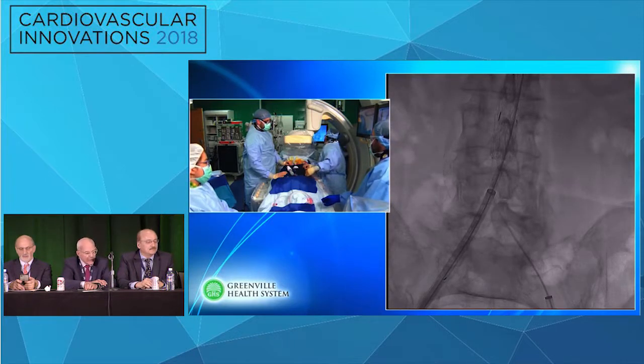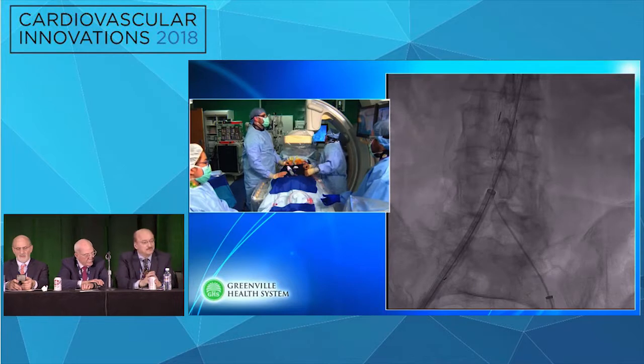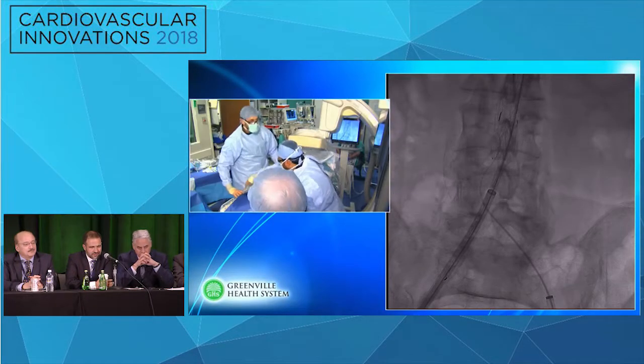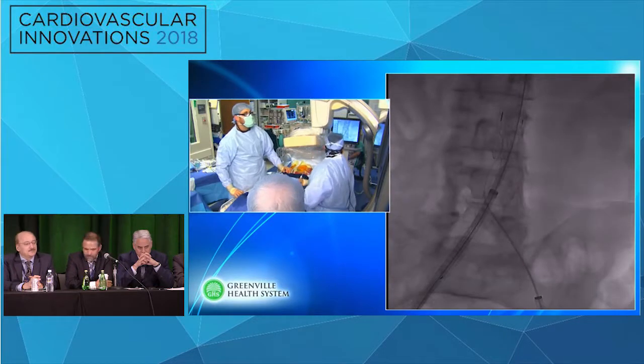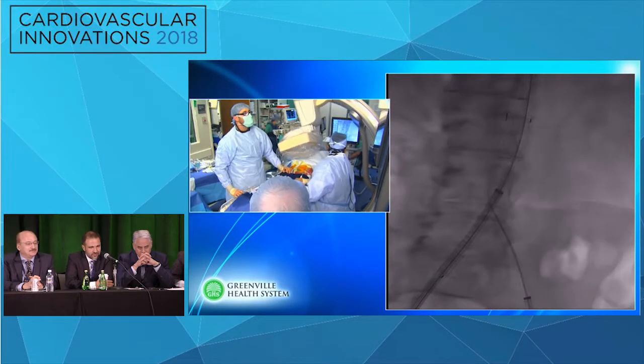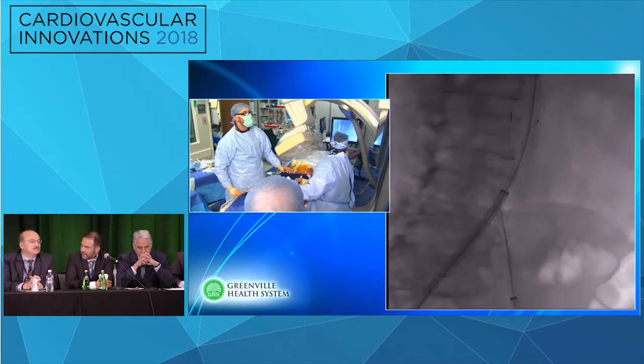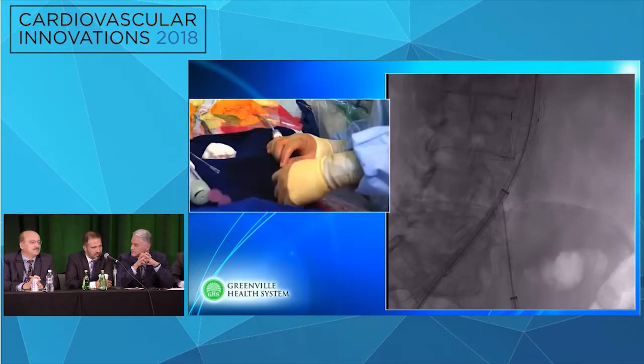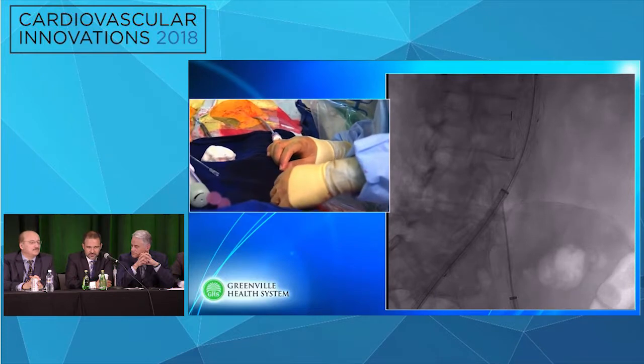I had a question for the panel. From a standpoint of cost saving and reimbursement for these endografts, my understanding is that your margin is very tight. There was a time that folks used to do a cut down, at least on one side, to kind of offset the cost. Is that now resolved, or what is your recommendation related to that?